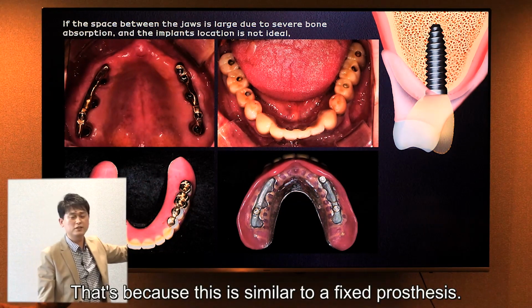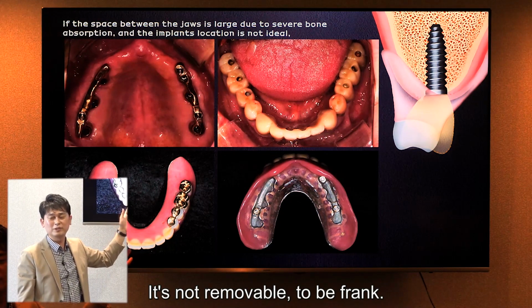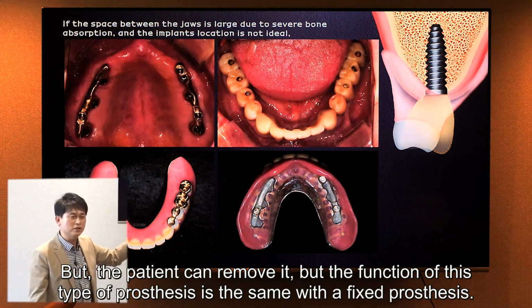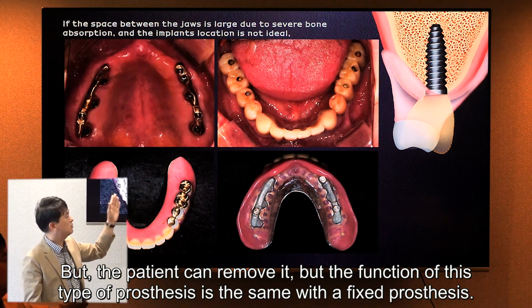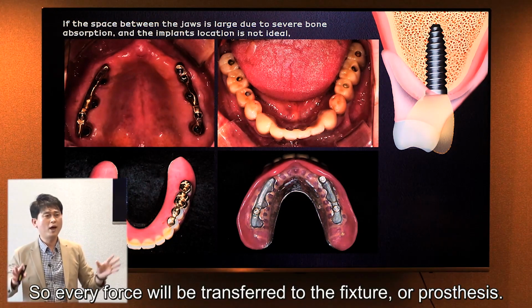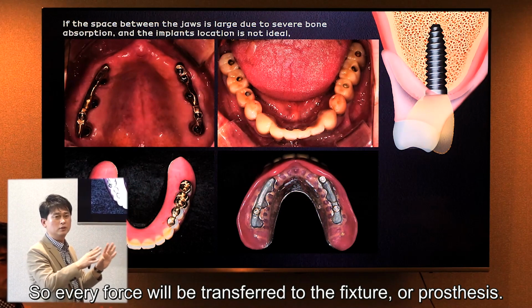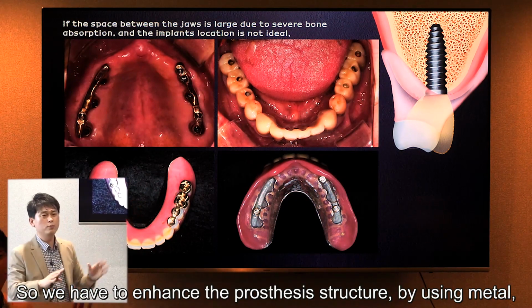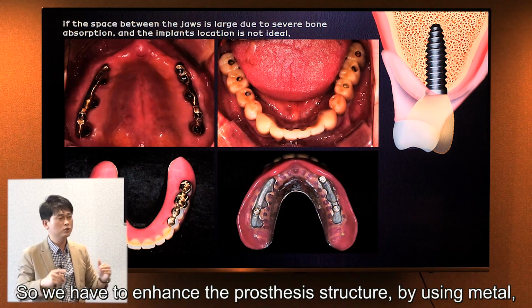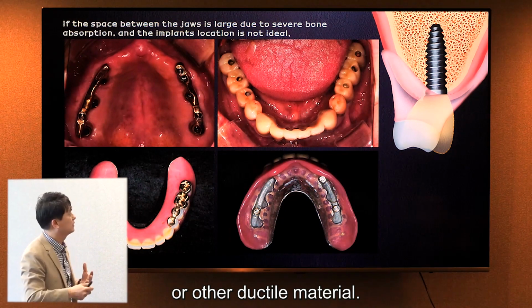That's because this is similar to a fixed prosthesis, not removable, to be frank. The patient can remove it, but in aspect and function, this type of prosthesis is the same as the fixed prosthesis. So every force will be accumulated on the fixture or prosthesis. So we have to enhance the prosthesis structure by using metal or other ductile materials.